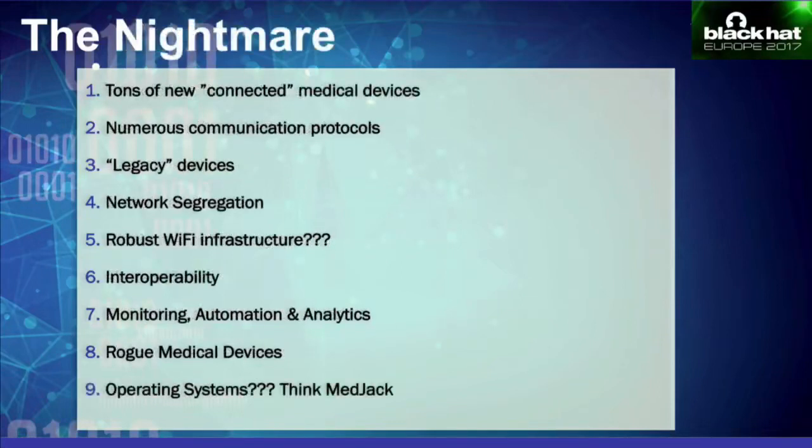Right. So we've talked about some of the benefits. Here I'll just touch upon some of the challenges that come with connected medical devices. I think one of the biggest challenges for medical and health institutions would be to support this large and growing number of connected medical devices. There are already tons of connected medical devices per bed in hospitals.